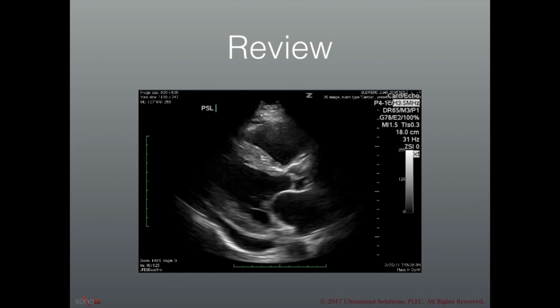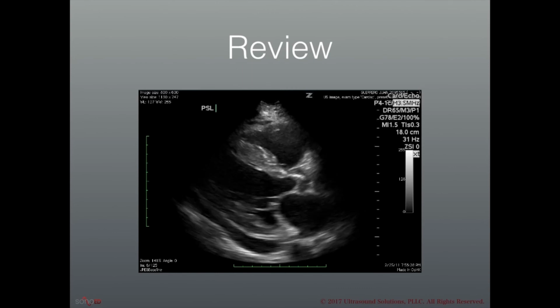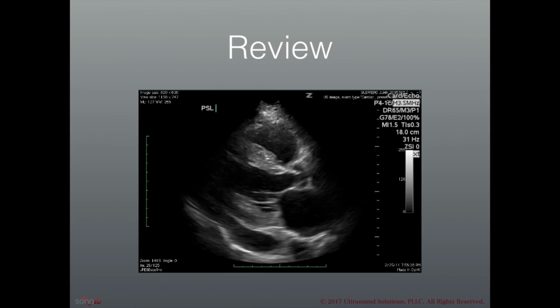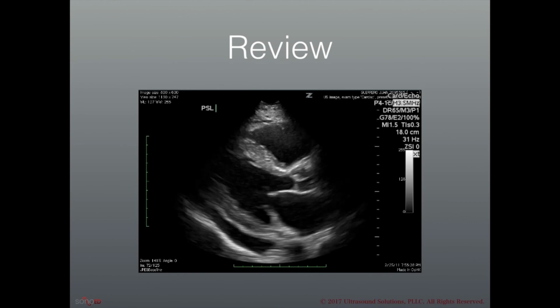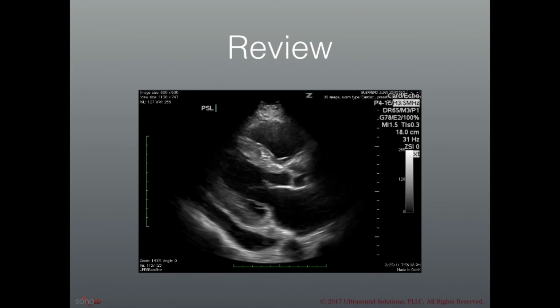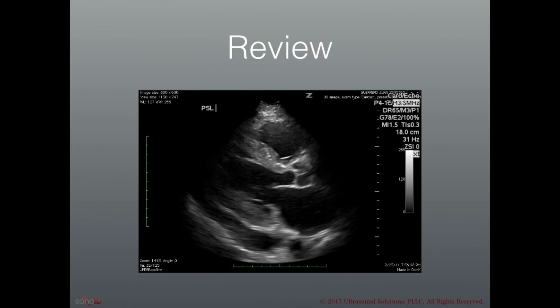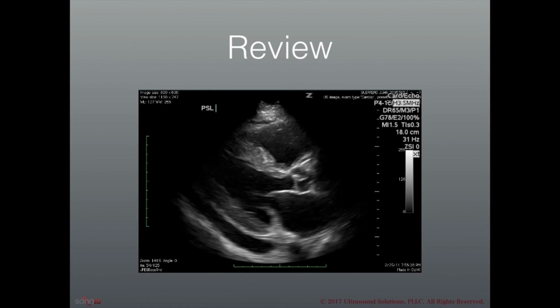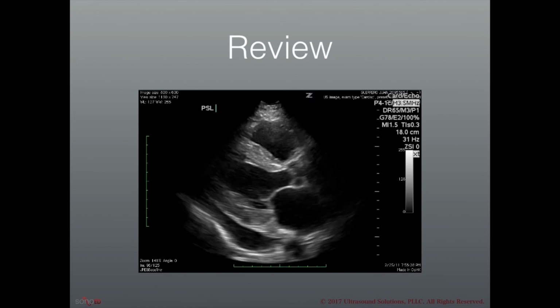This may actually be a pleural effusion as well, since you don't see it clearly going over the descending thoracic aorta, but because I see a little bit of fluid in the near field over the anterior aspect of the heart, and because on a couple frames it does seem to actually go over that thoracic aorta, I do anticipate that this was a pericardial effusion. But just be aware, those left-sided pleural effusions can sometimes be hard to tell from a small pericardial effusion, so always look closely.